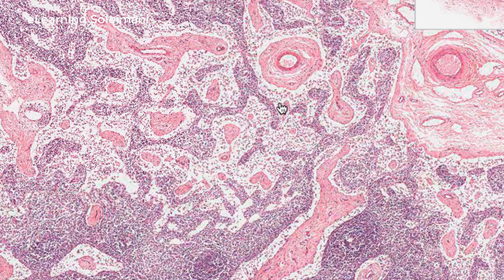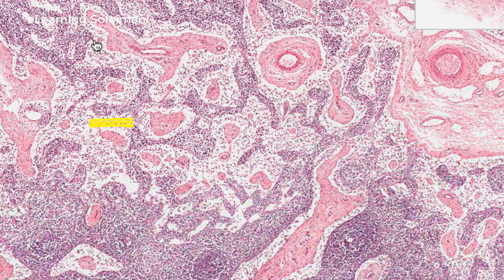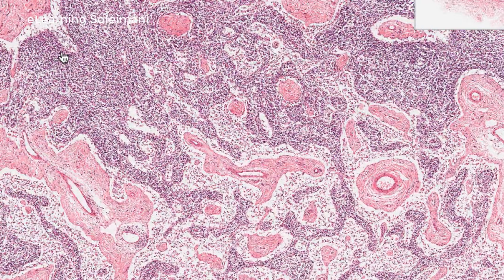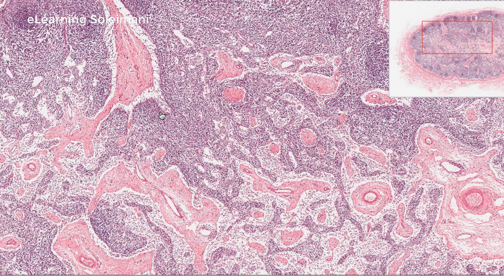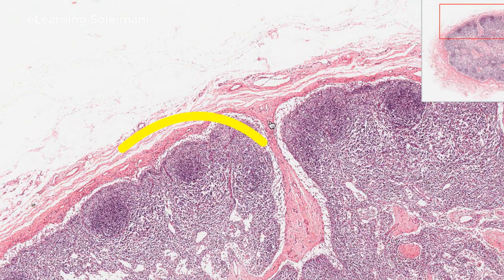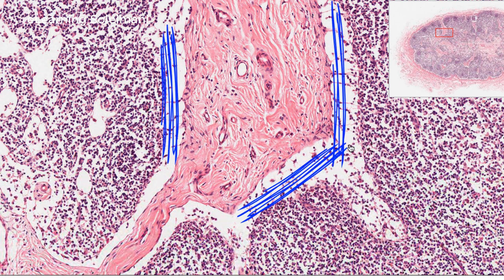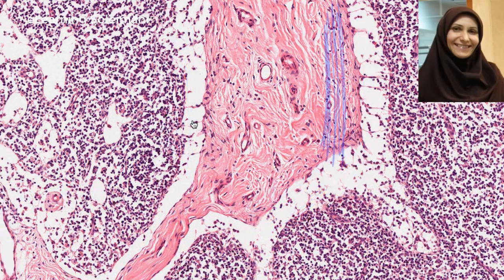The spaces seen between the medullary cords are called the medullary sinuses. The lymph node stroma is formed by reticular tissue. Also, the trabeculae coming from the capsule contribute to the stroma. These are the connective tissue trabeculae. The spaces seen around the trabeculae are called the trabecular sinuses.